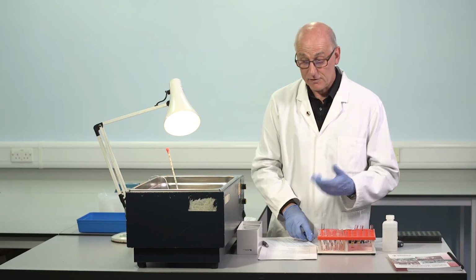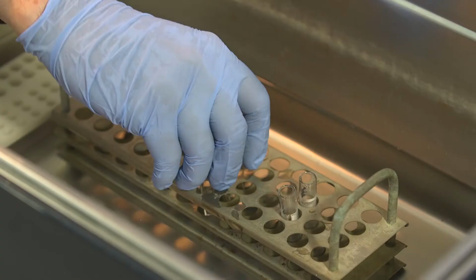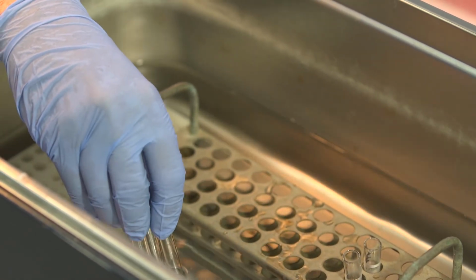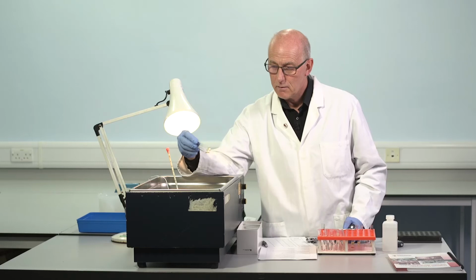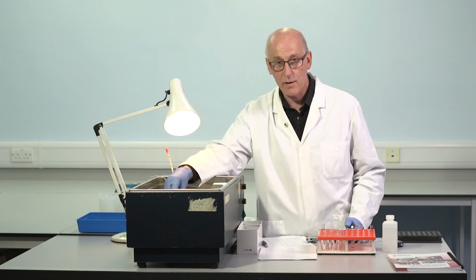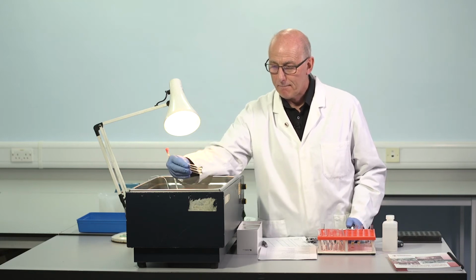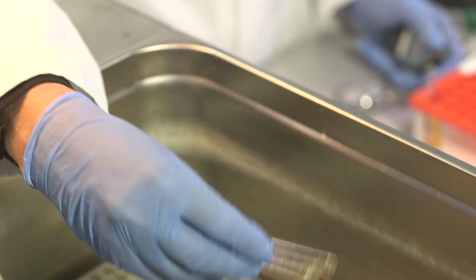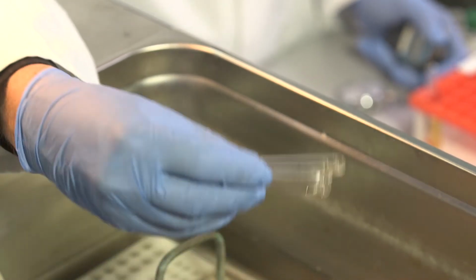So now the clotting is occurring once we've added the calcium. So now we need to again start the observation. The same regular tilting 3 times every 5 seconds through 90 degrees. And remember, this is the quality control sample.